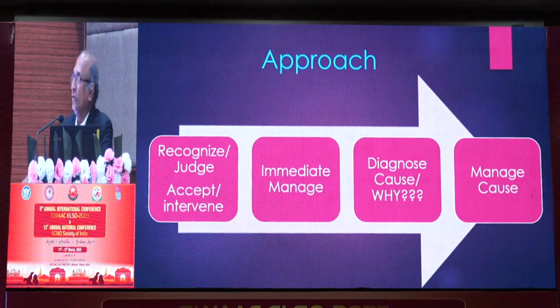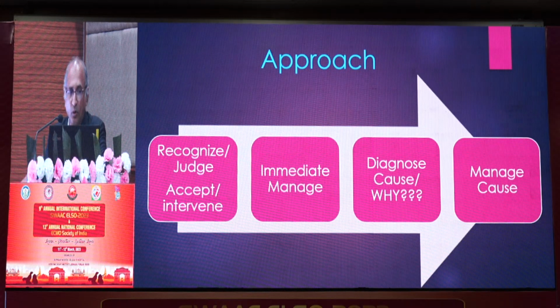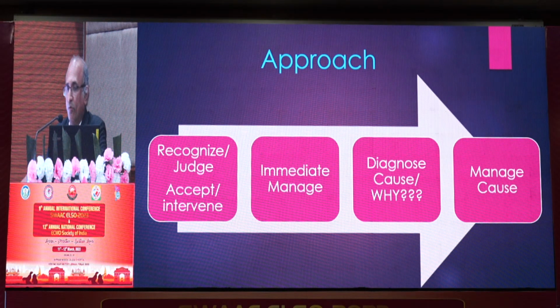Whenever you are approaching any troubleshooting, you first have to recognize it, and then decide whether you can accept it or you have to intervene. You should think about what the immediate management will be, what the cause is and why it has occurred, and then go for the root cause and manage it so that it doesn't repeat.